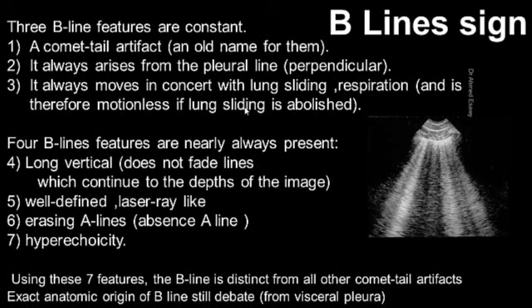Again, it moves in concert with lung sliding. This is an important sign: if it is motionless, lung sliding is abolished. So we find the B-line moves with lung sliding. If lung sliding is absent, it will be motionless.